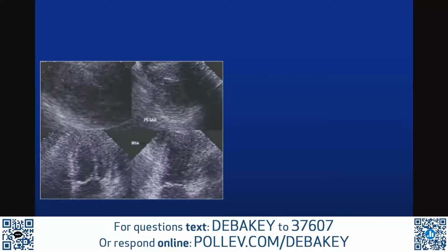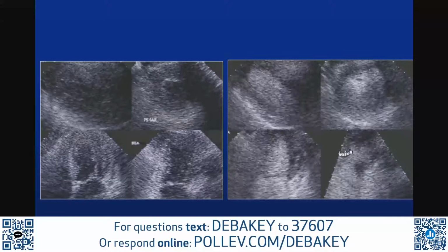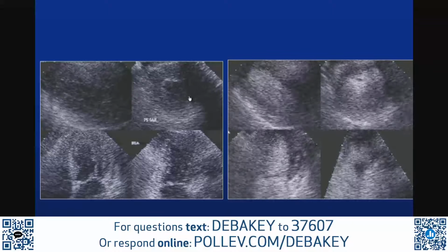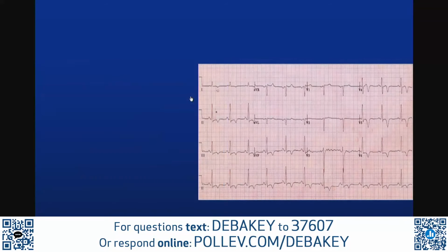So we brought the patient back and used contrast. And the interesting thing, as you can see, is that there is a very unusual localization of what turns out to be an aneurysm in the lateral wall. This is a 4-chamber view, and you could see where the sac is. Apically, it's fine, but this is very unusual. And what did the eye do? For my eye, and hopefully also many of your eyes, it interpolated this area and said, well, if everything else around it is normal, we'll interpolate it, and most likely it is normal.